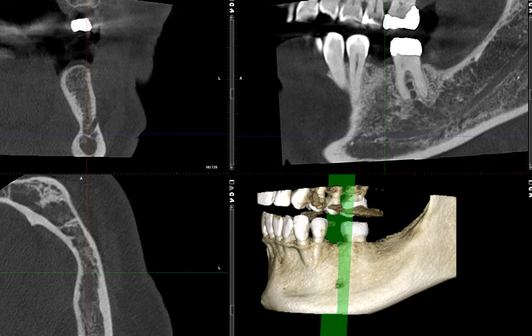Let me go ahead and measure the ridge. At about here we're measuring 9.68 mm — close to 10 mm — and at its narrowest portion it's about 5.14 mm. That's very important. If you're placing an implant in this direction, without understanding this concavity, it's easy to perforate the lingual cortex. That's why it's important to get this cross-sectional image.